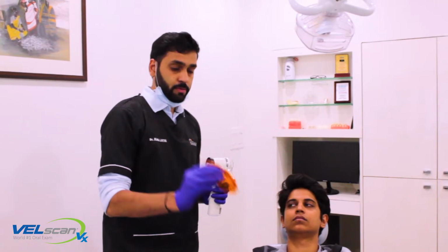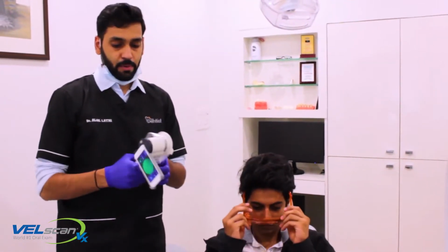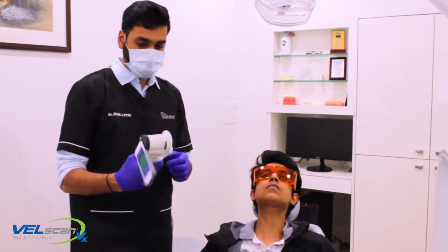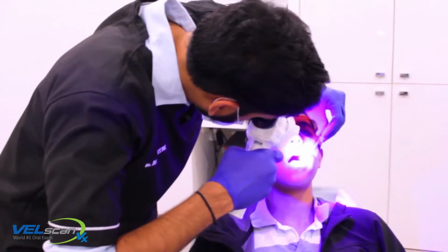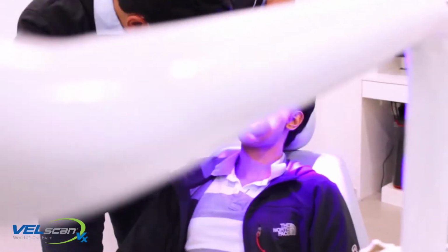And for protection of the eyes, we are going to ask the patient to wear this eye protective lens. So with this, when the doctor is ready with the mask and gloves as the normal protocol, we can directly assess the entire oral cavity. Now what we are looking for in this is any black spots in the oral cavity.